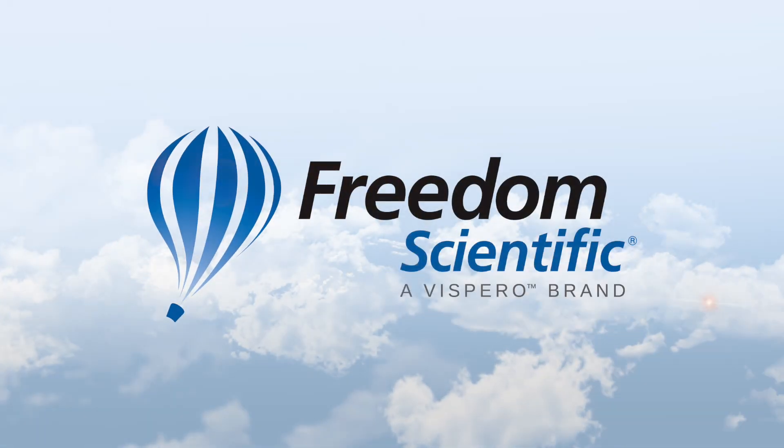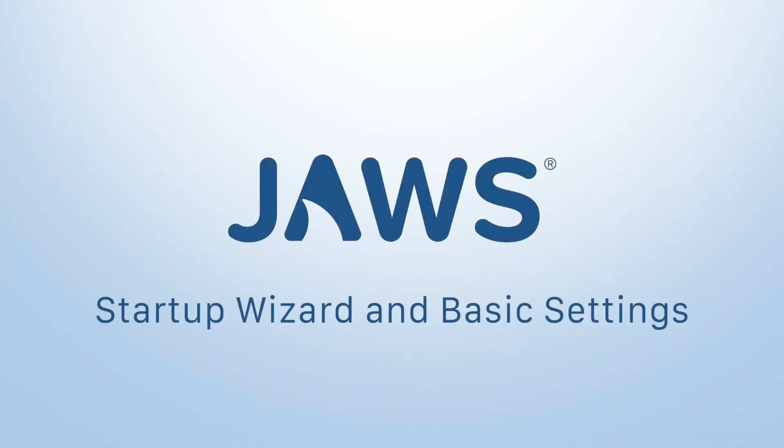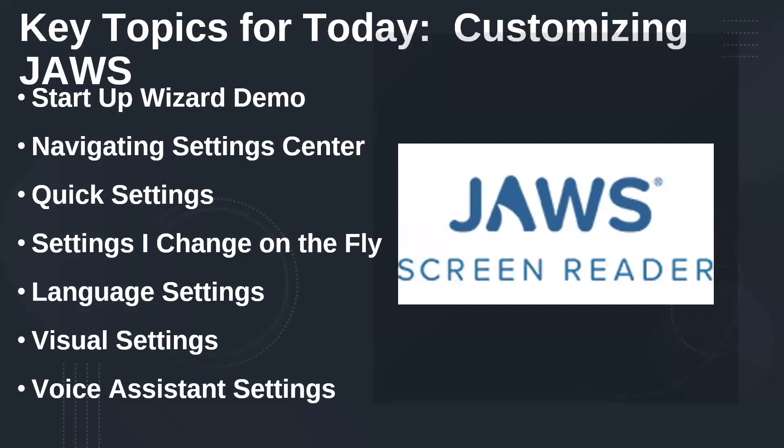Freedom Scientific, a Vispero brand. All right, let's just start it off by talking about the Startup Wizard. I'm gonna go ahead and demo that here in just a second. But the Startup Wizard allows you to change a wide range of settings or basically set up JAWS the way you want it when you install it.